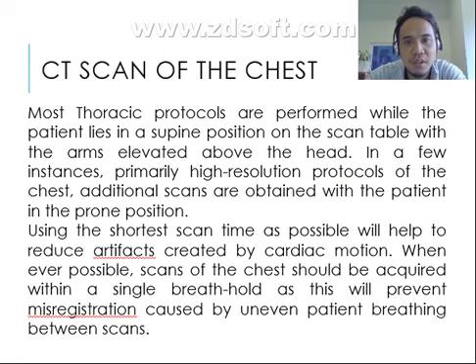Most thoracic protocols are performed while the patient lies in supine position on the scan table with the arms elevated above the head. In a few instances, primarily high resolution protocols of the chest and additional scans, are obtained with the patient in prone position, but it is very seldom that the patient is placed prone.